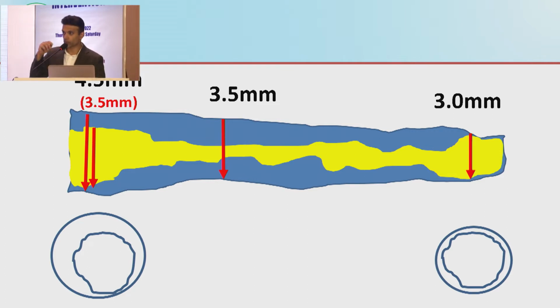Because then you don't have to worry about proximal landing zones and 30% plaque versus EEL to EEL diameter, right? That is probably the one exception to the usual rule of lumen to lumen stenting in the setting of plaque. Because your proximal landing zone is what governs your inflow. You want that to be as big as you can. And so force yourself as much as you can to go normal to normal, okay?